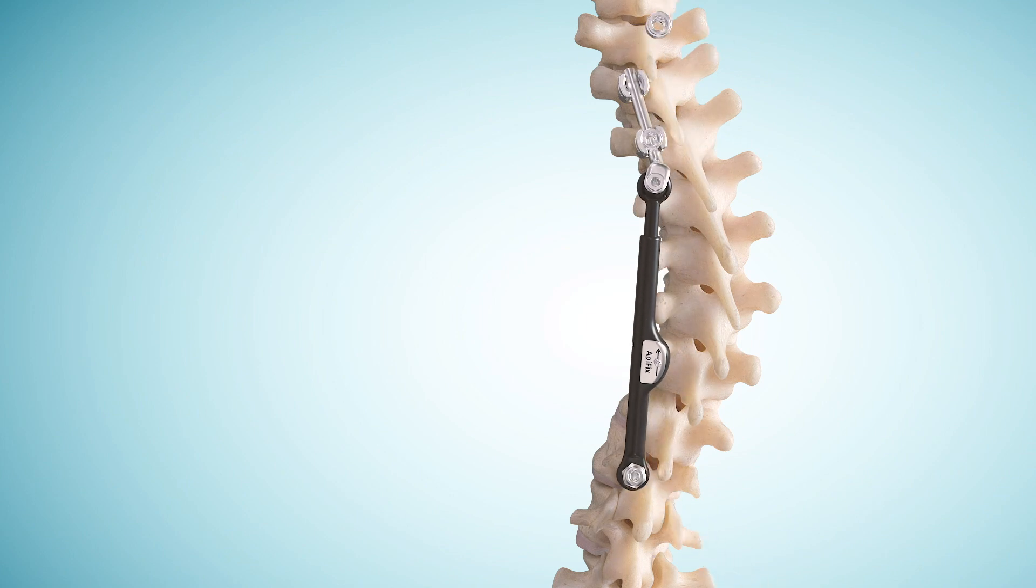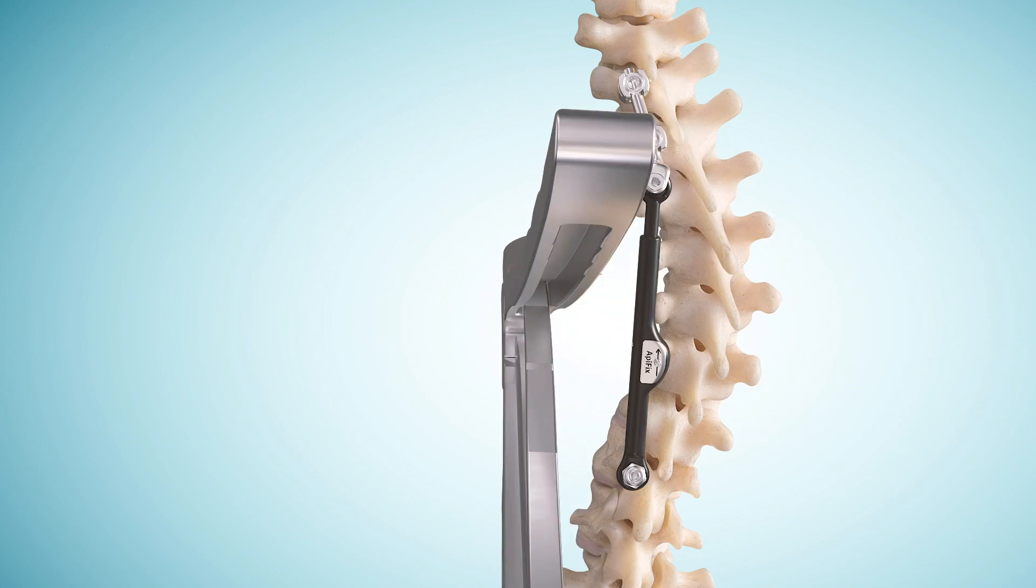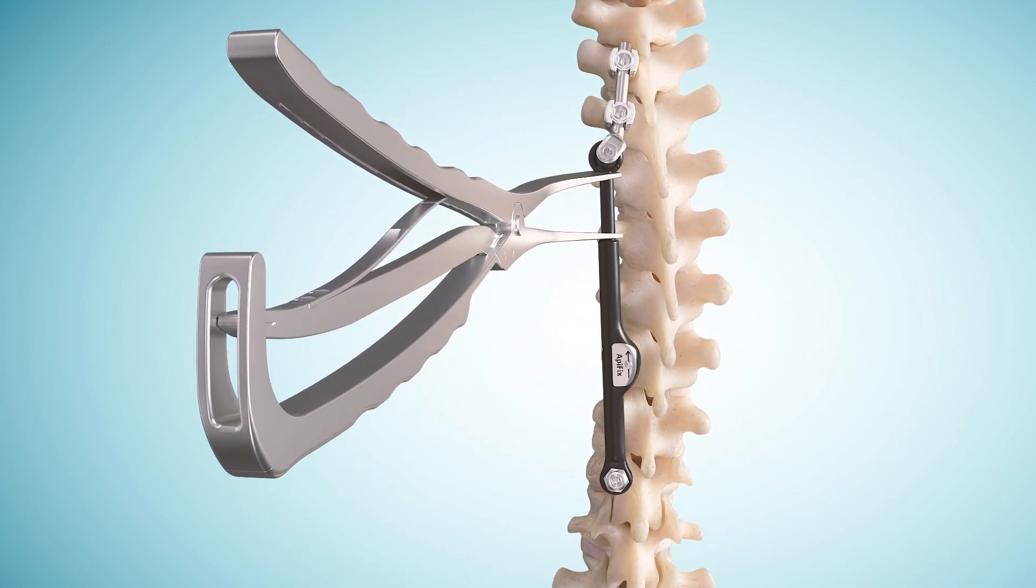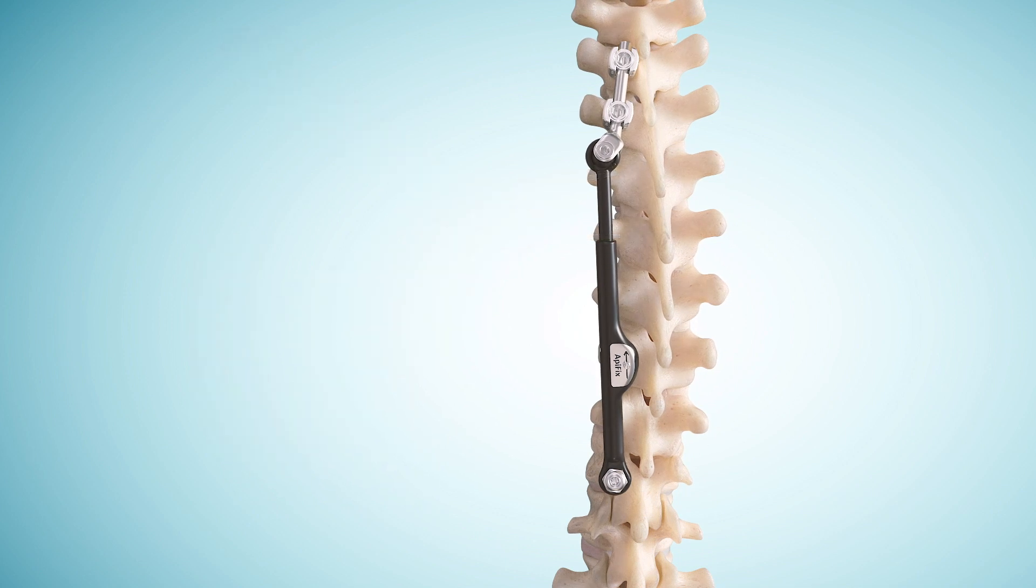A distractor is introduced to elongate the rod and achieve curve correction. The unidirectional rod passively allows for additional elongation post-operatively to accommodate for growth or additional curve correction over time.